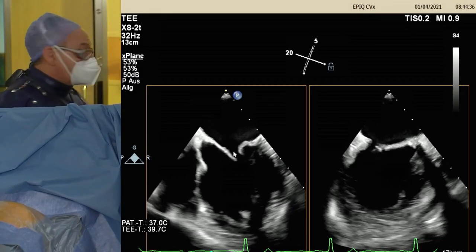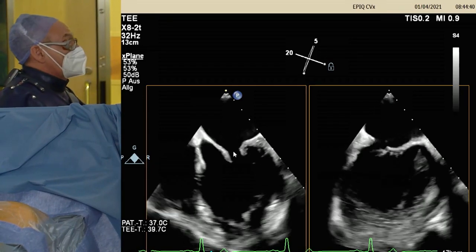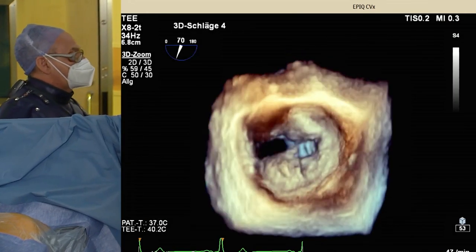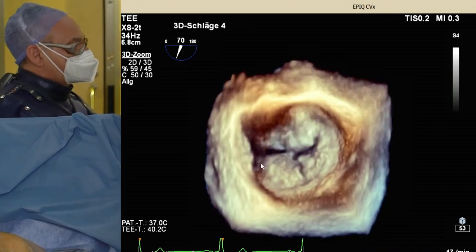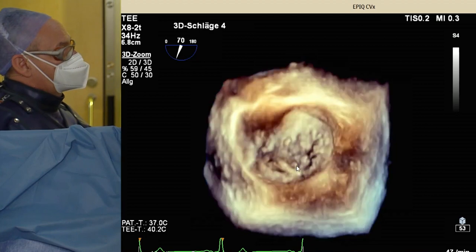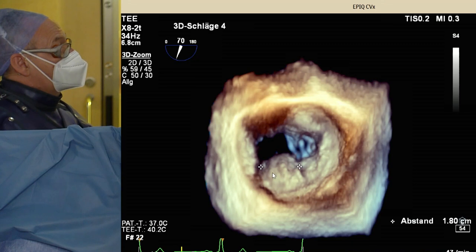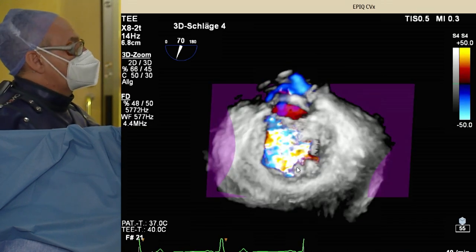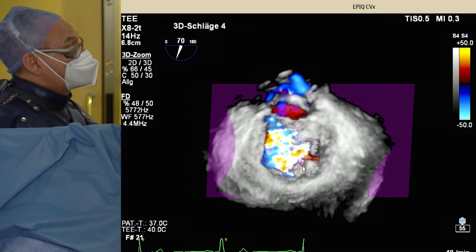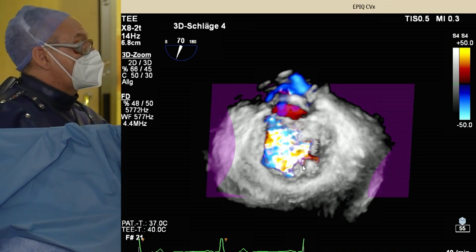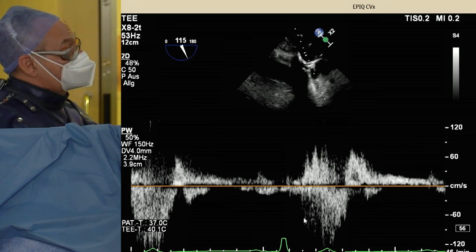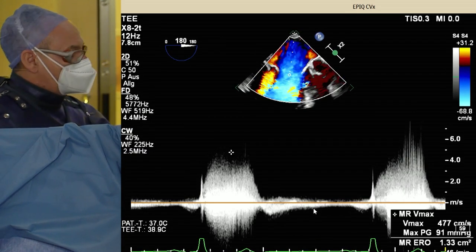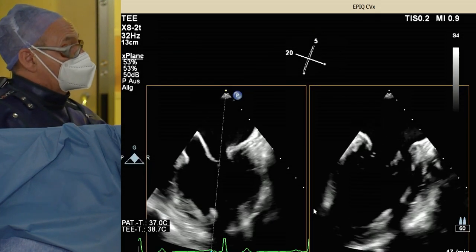On echo, LV function is good. The 3D recording of the valve shows prolapse at the more lateral part of P2, with possibly a small indentation and a ruptured cord. The width of the prolapse was measured at 1.8 cm in 3D and 1.6 cm in 2D. Color Doppler shows flow regurgitation at the prolapse site, with systolic reversal through the pulmonary vein. EROA measured by PISA was 1.3 cm², and the biplane vena contracta was 10 millimeters.